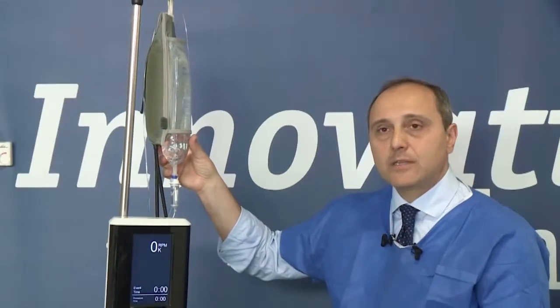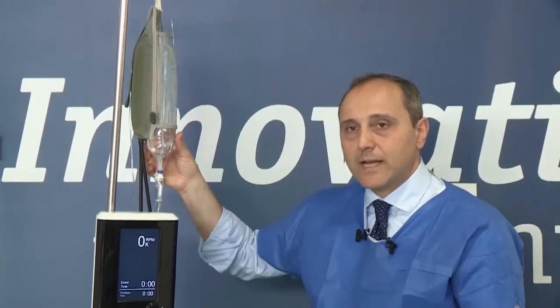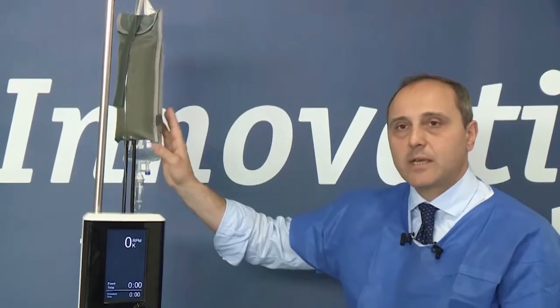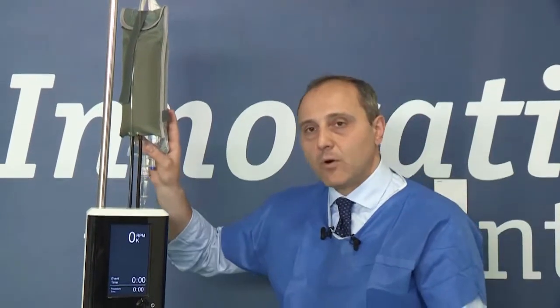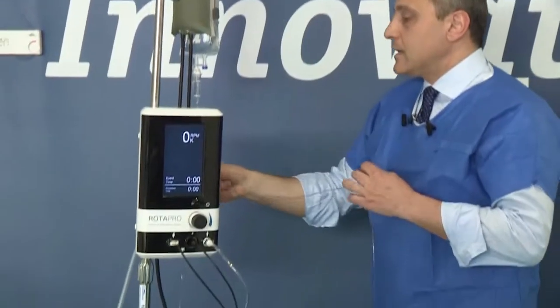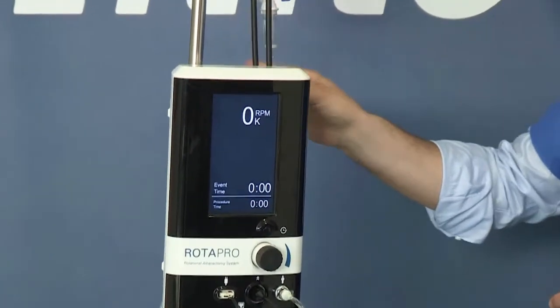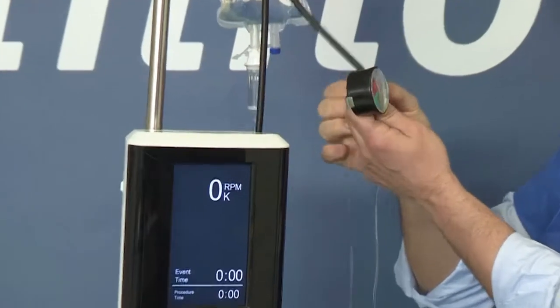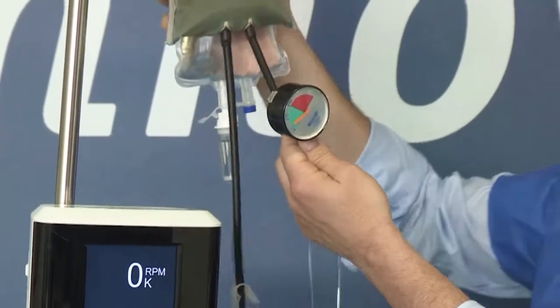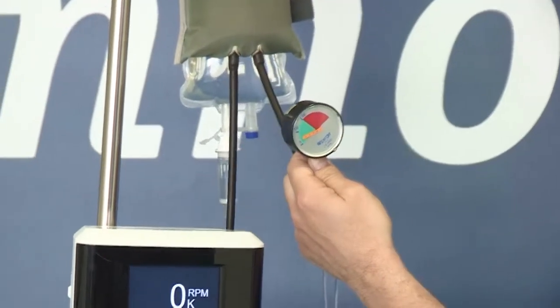That, as you know, might be composed of saline, heparin, calcium antagonist. There are different variants, but you can learn more about this if you look at the video on PCR Edu online. So normally, the saline should be under pressure. It is always good practice to check what is the pressure within the bag here. It should be around or above 100 millimeters mercury.